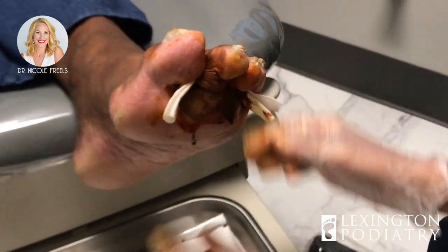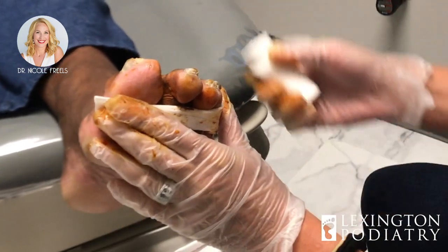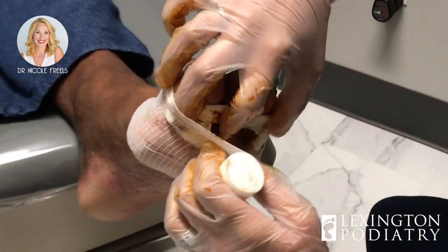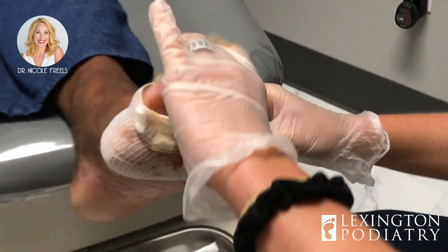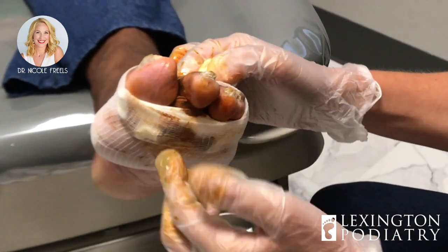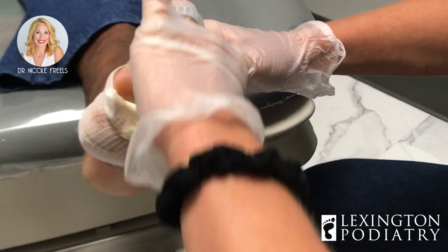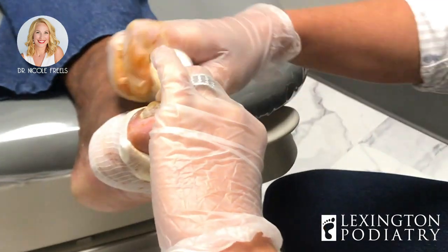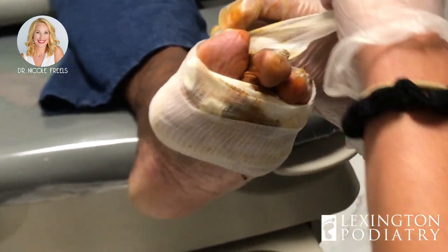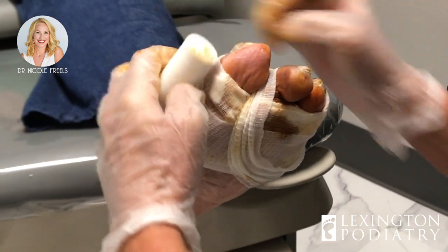Look how much better. We're going to weave the gauze in a fashion in between the toes. The release we do is at the IP joint. There's a joint right behind it called the metatarsophalangeal joint, or MP joint — right in here I'm really trying to encourage this downward motion to allow that to straighten out. That's the area we're really going to be focusing on when you return in a week. Leave this bandage on — do not remove it. In a week you can go back to work, you can do whatever you want.